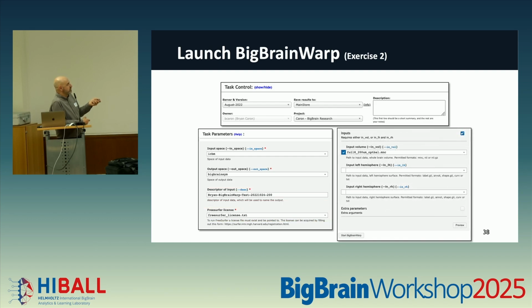But tell me what you see. What do you see when you click on the menu drop-down for the input volume? When you click the arrow down, in my case, because I put, what did I put the checkbox beside in the menu?